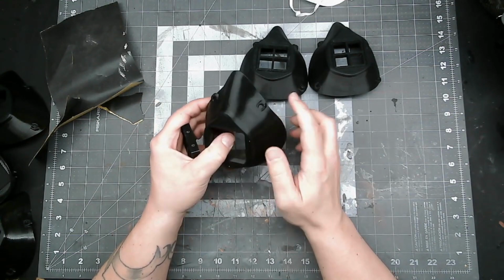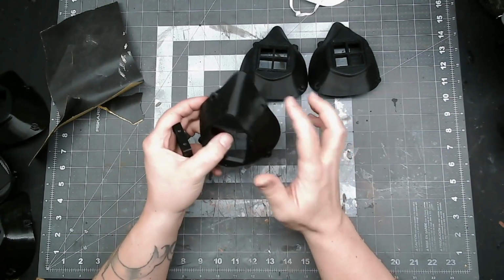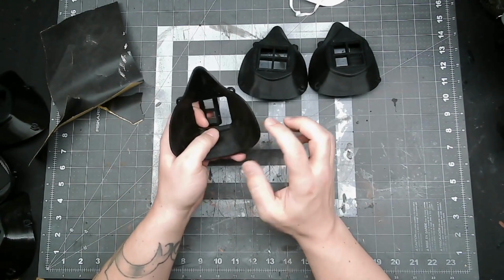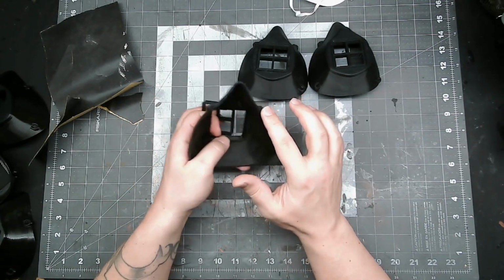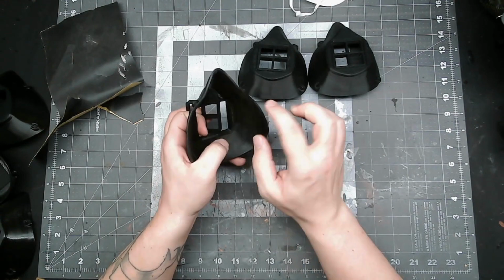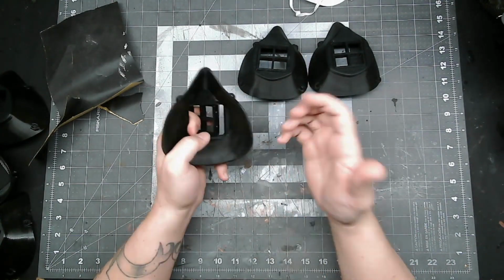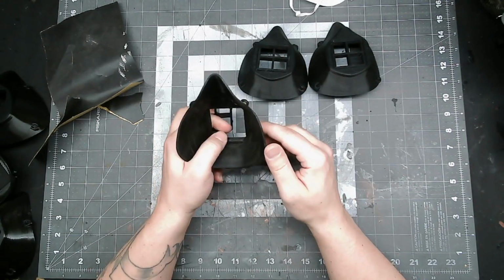These do still need straps for the attachment points here, and they need a filter. This is the insert. And it really helps to have a gasket of some kind around here, like a split rubber hose gasket or just a self-adhesive you can stick along the inside. It'll help with the seal. It's not necessary, but it helps. And it definitely helps with comfort.